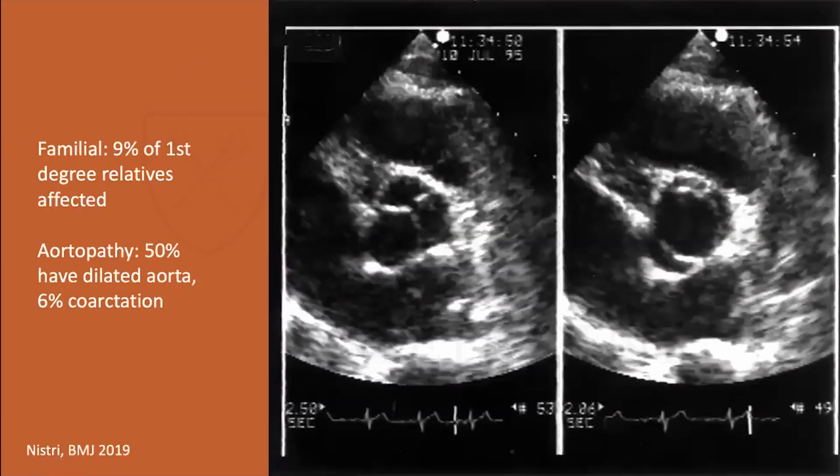A couple of important things to note for bicuspids is that you really have to see the valve in systole, because in diastole, if it's a type 1, they will still have this raphe there, and that can fool you into thinking that there are three discrete leaflets that open, right? But only in systole do you see that this one right here does not open.